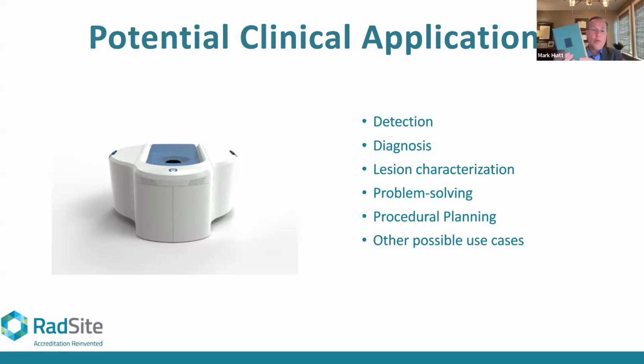And here I have something that we used to have prior to the current technology of digital books. And this is Don Quixote. And it kind of illustrates that through traditional means of mammographic acquisition, it was all 2D, right? So the X-ray beam would go through the book, and it's as if you're attempting to read the book, not page by page, but rather from the front cover to the end cover. And so that's kind of the problem of conventional traditional means of diagnosis.